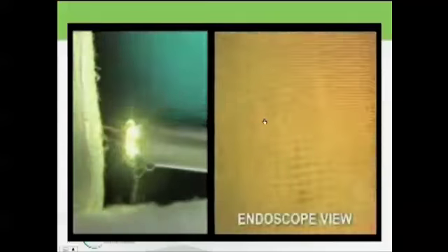Okay, so I think you got the idea. The next slide I'm going to show you, before I start it, is something they have to play with a little bit, because when the device is on, it stays clear the whole time. So if I just show you a video, you'll see some blood from a liver, gallbladder, and touching the liver, and you'll see a smudge on it. The only reason there's a smudge is because the device has been turned off. What you'll see is that when they turn the device on, the image clears instantly. When it looks clear, a switch has been made to keep it on. Otherwise, you wouldn't be able to tell that there's a smudge, because there's no smudge.